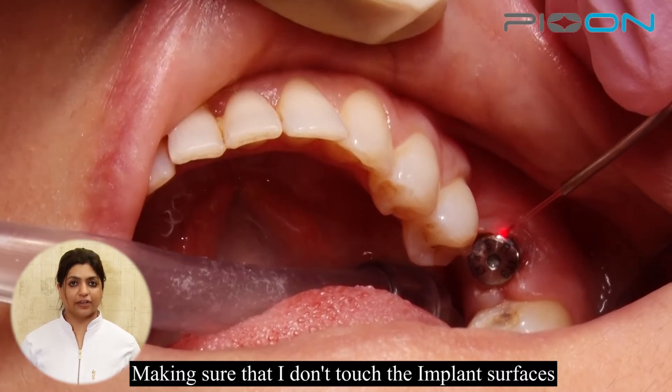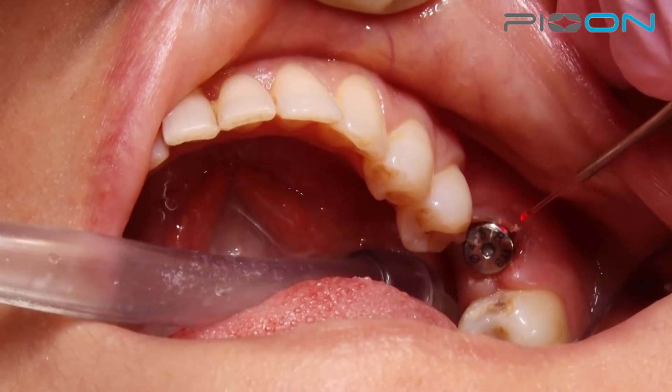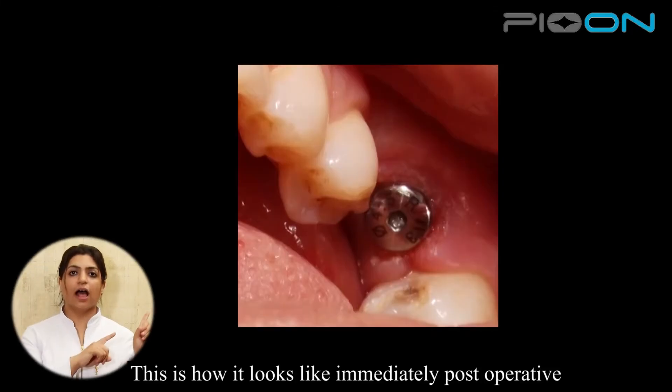Making sure that I don't touch the implant surfaces. This is how it looks immediately postoperative.